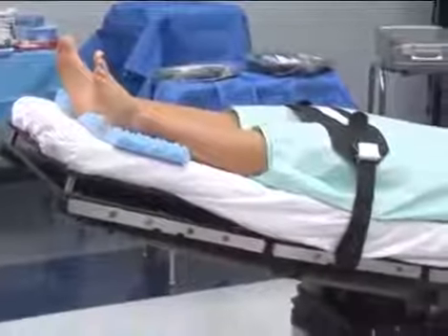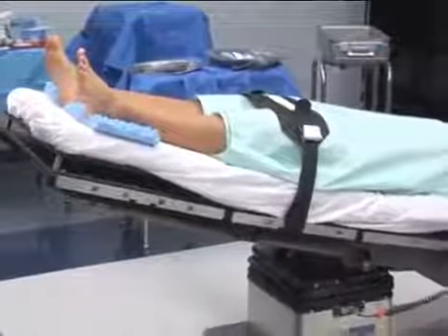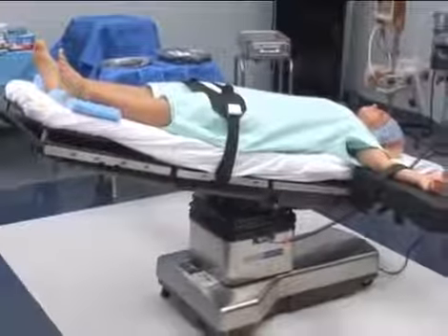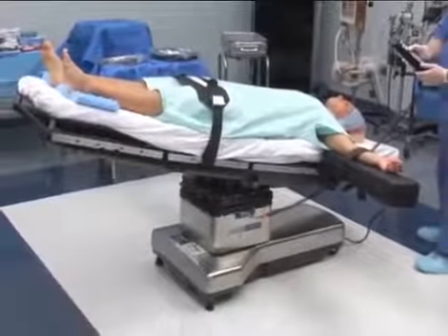Shoulder braces may be used to prevent the patient from sliding. Shoulder braces may be very dangerous, however, and may cause injury to the brachial plexus. If it is necessary to use them, they should be well padded and placed over the acromion process of the scapula, rather than over the soft tissue overlying the brachial plexus.